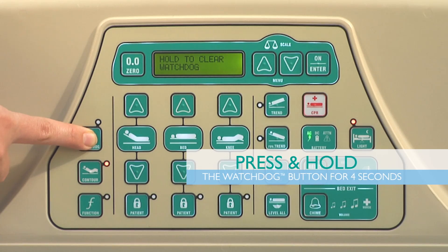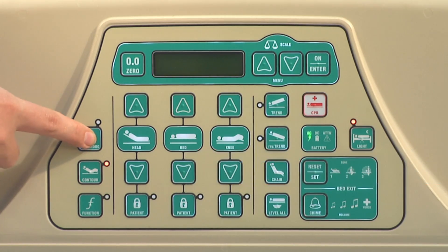To deactivate any Watchdog feature, press and hold the Watchdog button for 4 seconds. The Watchdog lights will turn off and two beeps will sound.